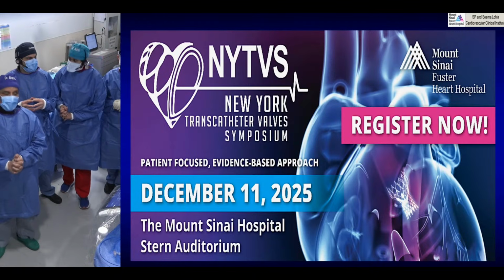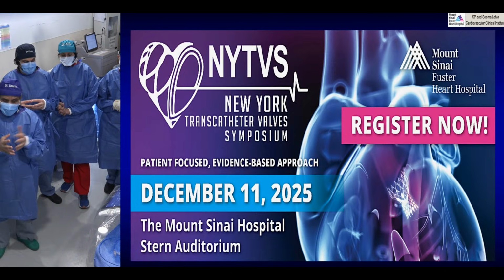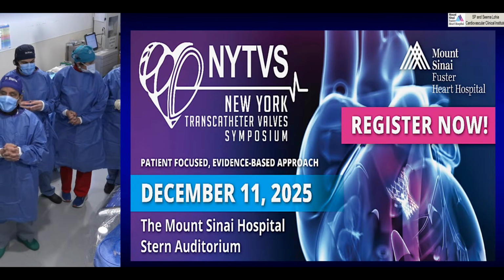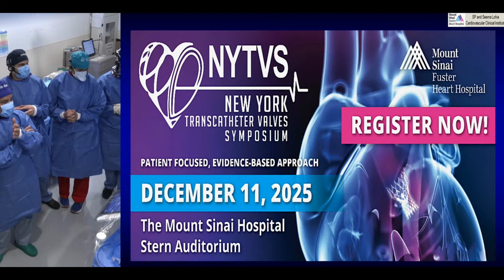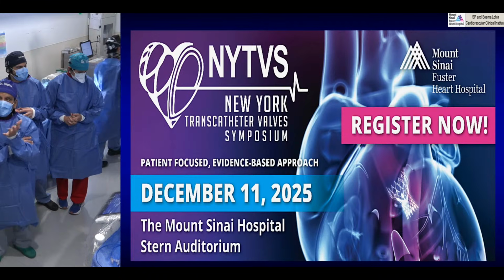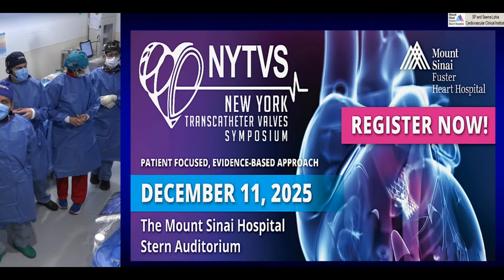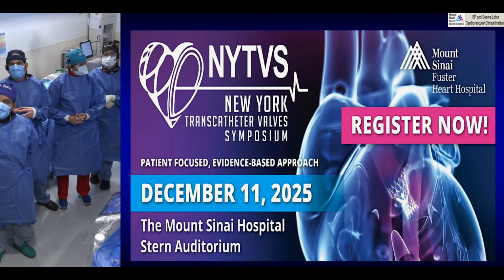People say we are bored with the TAVR, you need to show something different. So we are actually not only going to show cases like a small aortic annulus, more importantly some valve-in-valve, and leaflet obstruction and coronary obstruction using the ShortCut device, which was approved a few months ago. And we'll be using that in one particular patient, maybe more, just to prevent obstruction, which is a big forward leap compared to what BASILICA used to take so much time. Now you'll see how quickly, within a few minutes, you can cut the leaflet and implant the valve. So a lot of new things will be shown during our transcatheter valve symposium, and we invite everyone to come here, and we'll try to make it available through online access also.